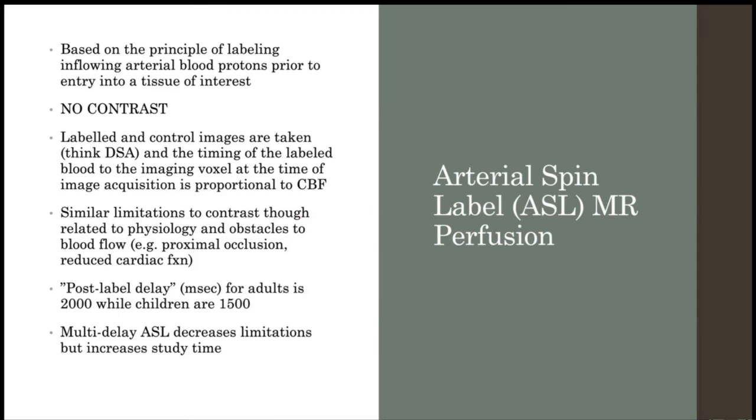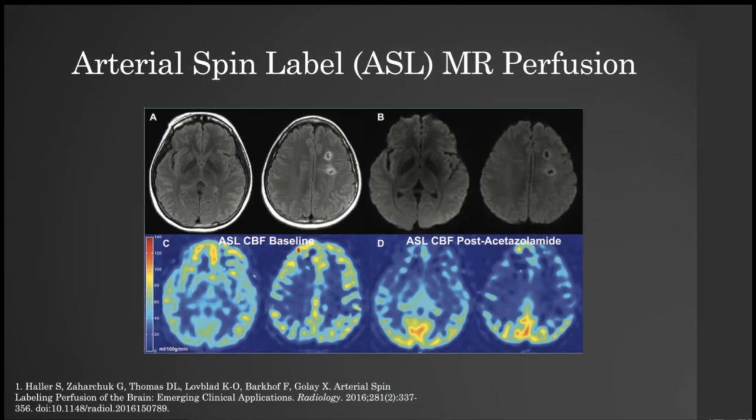The arterial spin labeling, MR perfusion is coming. I've talked about this a little bit, and so just some examples of what we can see. The lower frame there, the color frame, is the baseline and Diamox ASL. So that's very doable, and you're starting to see kind of an uptick in our MR perfusion.